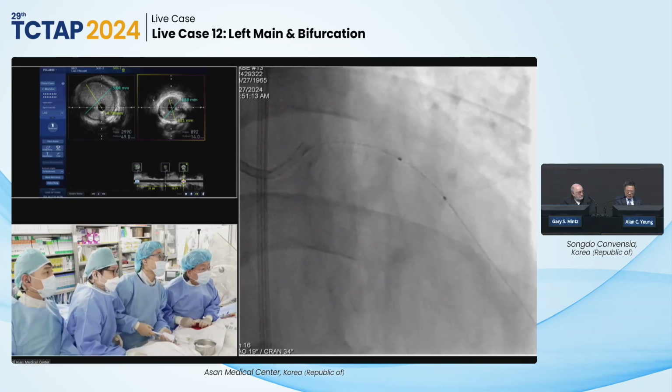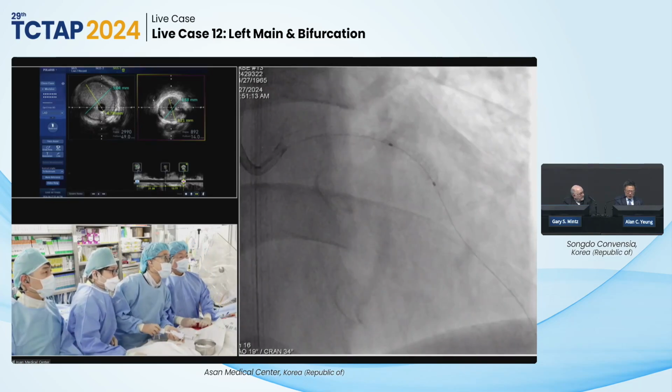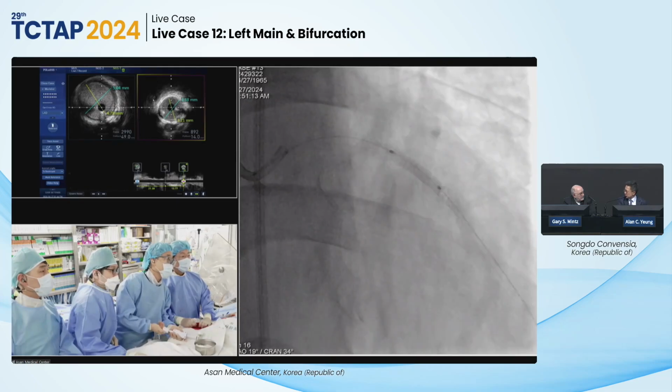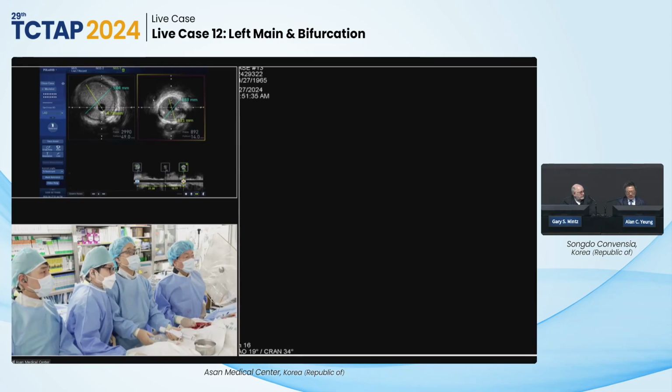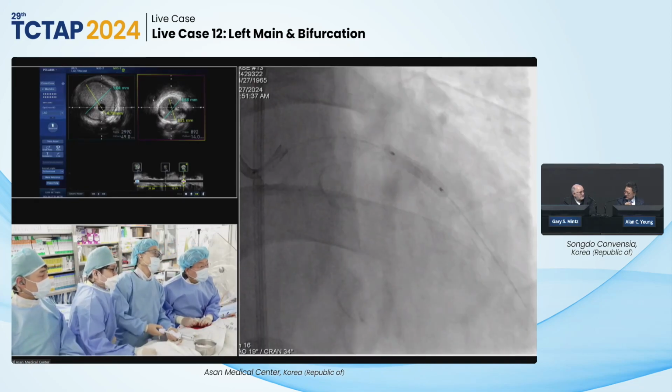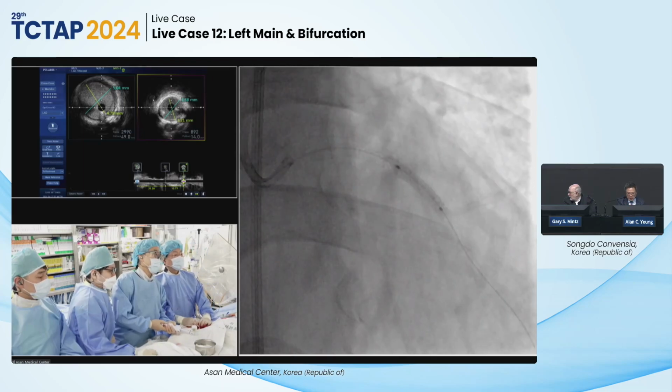So Gary, you asked the question of the role of the fistula. Most of the time, even a horrendous looking fistula is not physiologically significant. Here I cannot see exactly where it comes off, maybe distal left main, proximal LAD. Most of the time, nothing to do.